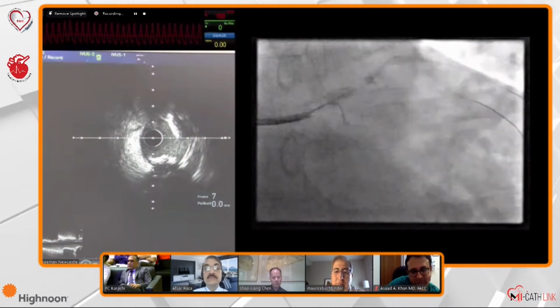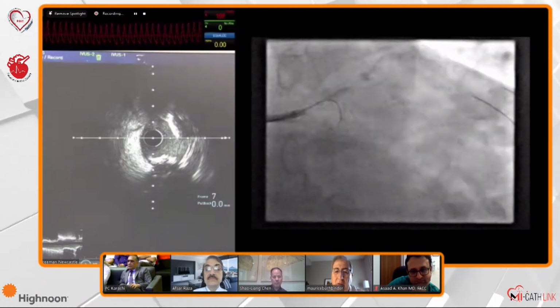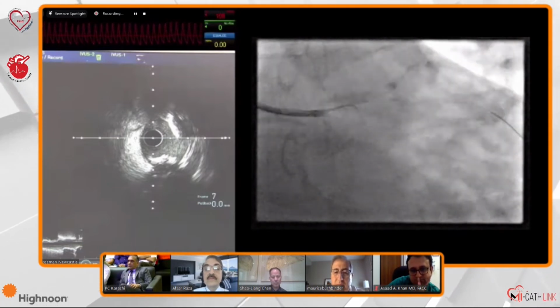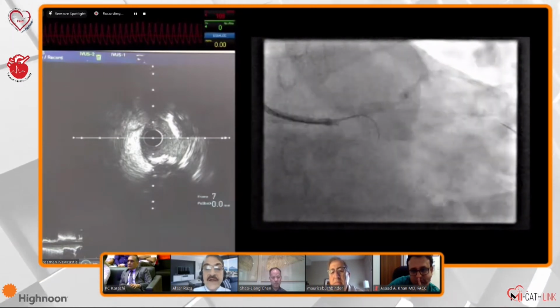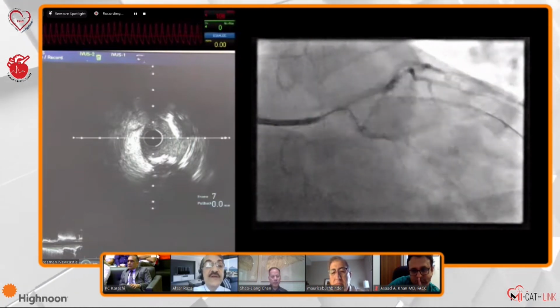But it's good. It helps you to optimize your result. If I'm going to use IVUS, I might as well use it from the beginning. Why only use it at the end? Because it might help you on occasion to change your strategy. This is my view. We have two more panelists who joined a bit late.